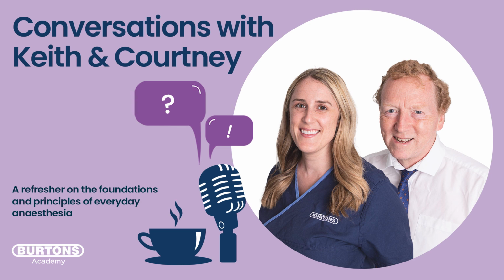I just want to throw one thing into the mix now. If we have dead space, and we haven't talked about this and we haven't got a podcast on it yet, but if we had a significant dead space, then just imagine our phase 3 line went up, went along during normal expiration, then we had a pause, and then we had inspiration, but we had a lot of dead space. That line would continue flat even though we had inspiration, because we were pulling back in CO2 from the dead space, and then it would start to fall. So now we've elongated our waveform even further, and we couldn't see that on a traditional capnogram.